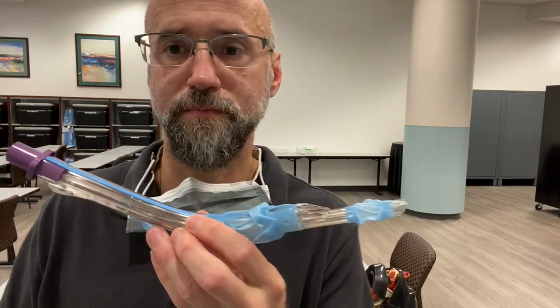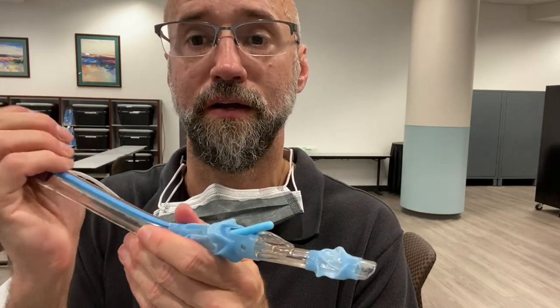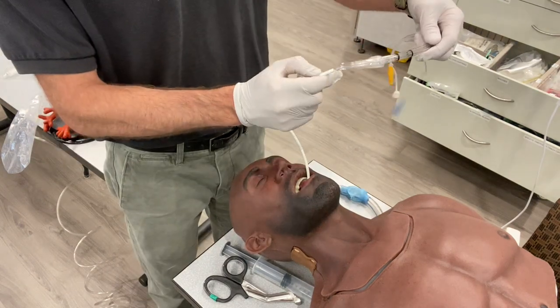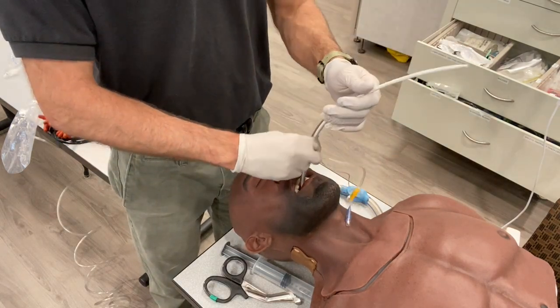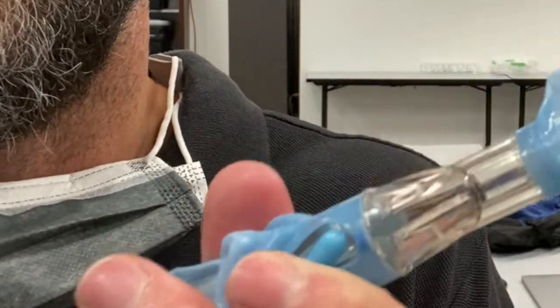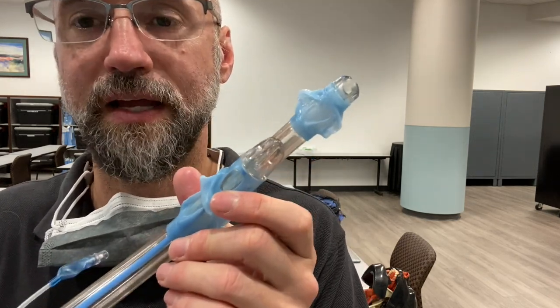To change it, it could just be removed and then an endotracheal tube passed the normal way. In theory, you should be able to take a bougie, pass it through the King Airway tube, and it should come out directly over the trachea and pass in, allowing a Seldinger technique where an endotracheal tube can be passed over the bougie into the cords. However, in reality this doesn't always work. The bougie can hang up on a small lip and not come out, the port may be directly over the esophagus if the King is too proximal or distal, and the bougie may strike the side of the esophagus, missing the trachea entirely.